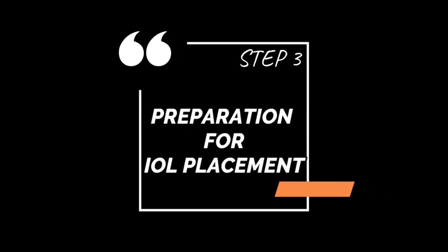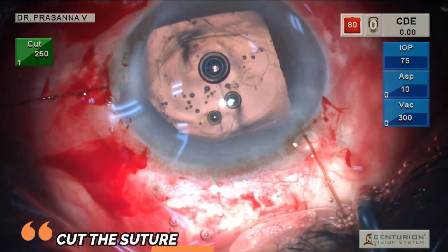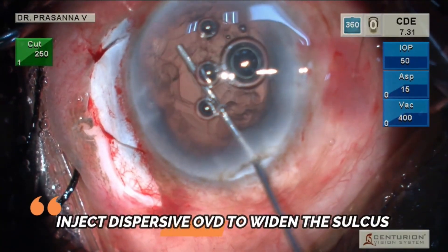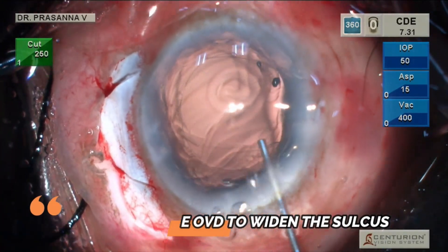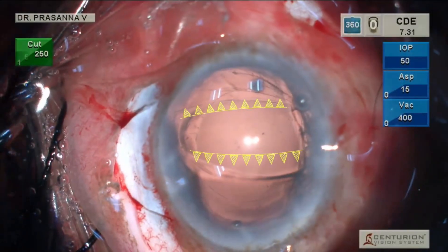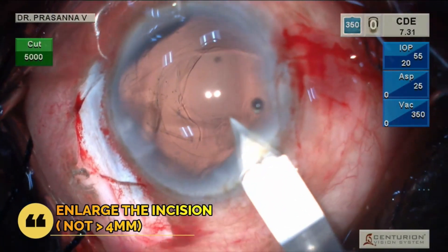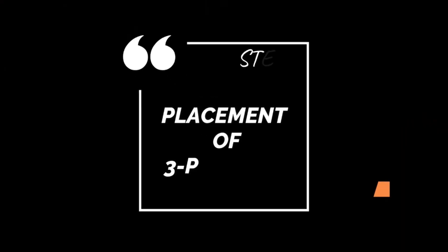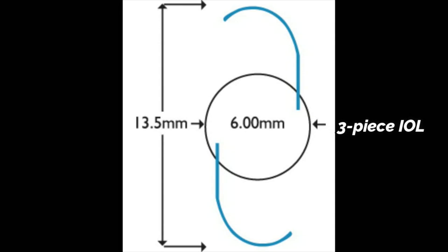We now prepare for intraocular lens placement. A dispersive OVD can be used to plug the rent and reform the sulcus. Enlarging the incision slightly will enable easy insertion of a three-piece intraocular lens through a B cartridge. A three-piece intraocular lens, because of its design, is best suited in eyes with a compromised posterior capsule, both in FACO and SICS.